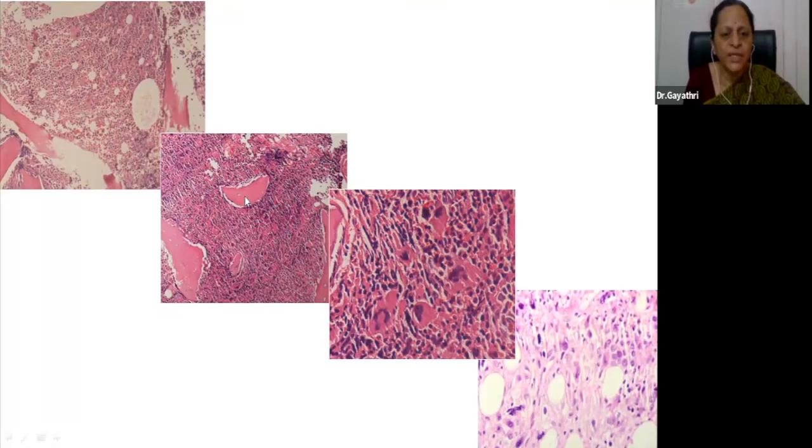They are distributed right across between trabeculae, and this marrow is showing hardly anything else other than the cellularity and some extent of streaming. So you will expect that this is a disease in which megakaryocytic abnormalities are an integral part. Look, these are distributed more evenly, whereas here they are distributed in clusters and right across, with no fat spaces at all in this trephine section.